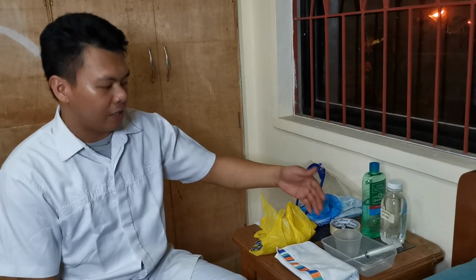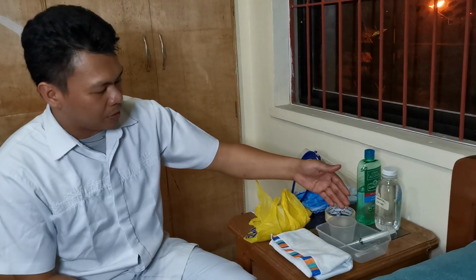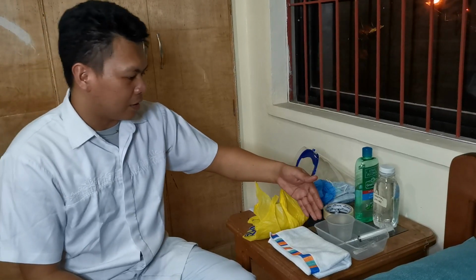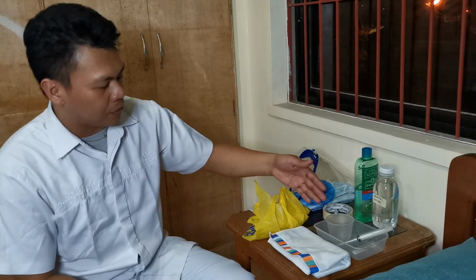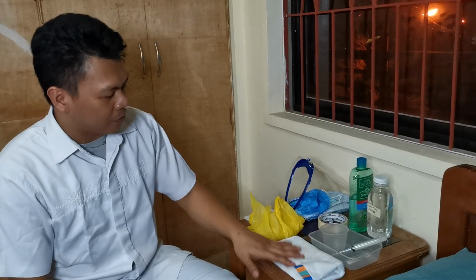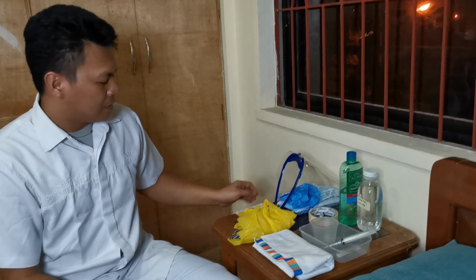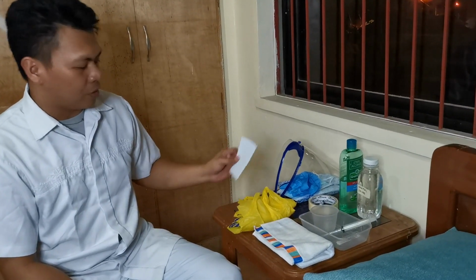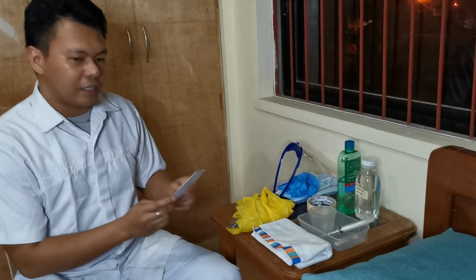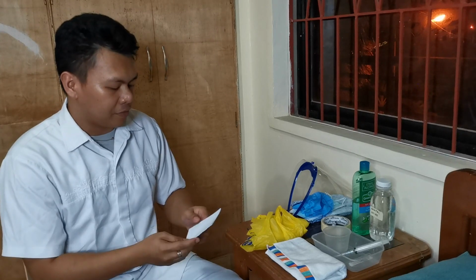If you don't have any kidney basin, you can make use of any Tupperware or container that you have. We have our syringe with the angio catheter. We have our cotton buds for getting a specimen. We have our waterproof underpad. And then we have our biohazard bag, our dressings. If you don't have any dressing or gauze, you can make a makeshift dressing from bond paper.